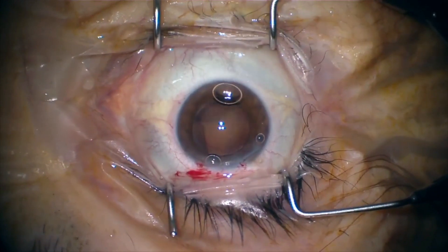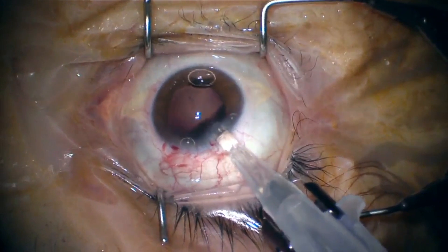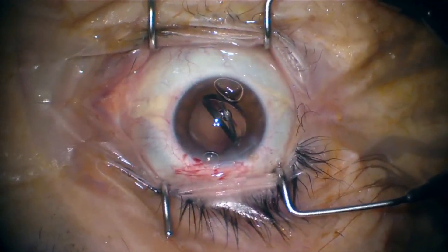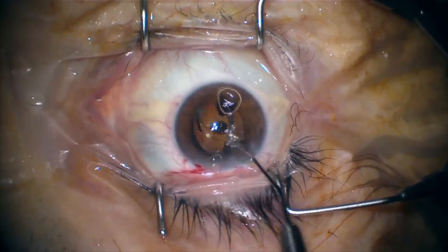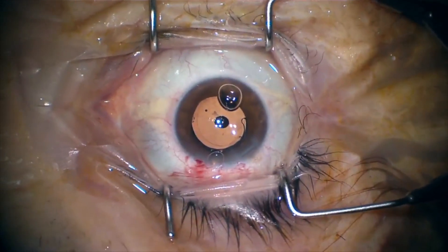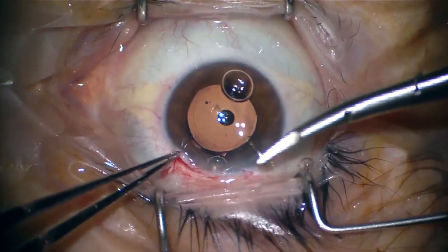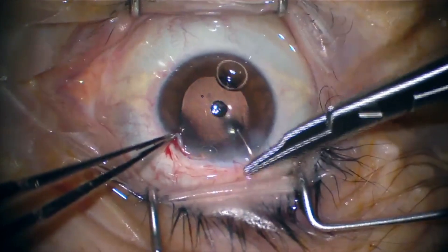It is important to notice that the cartridge we use to insert the IOL is a D1, and we have to watch how we are placing the IOL because in the process of insertion one of the haptics may be amputated. We then verify that the IOL is properly placed within the bag, and here is where I place the nylon suture at the main incision.